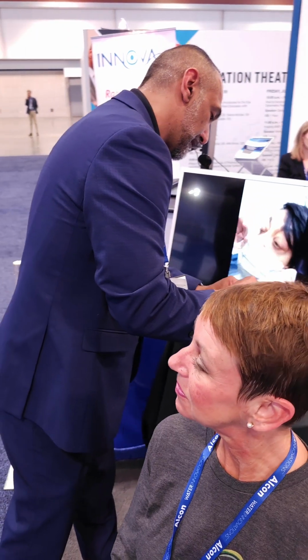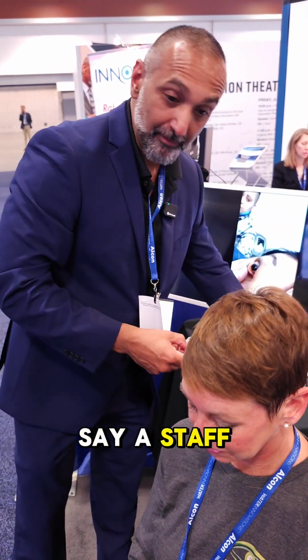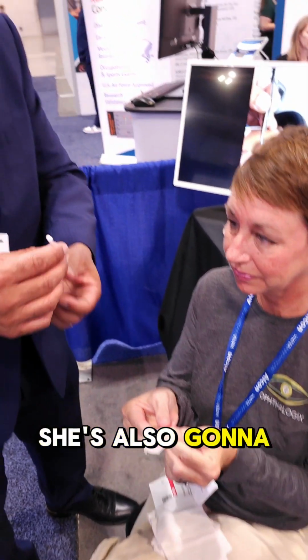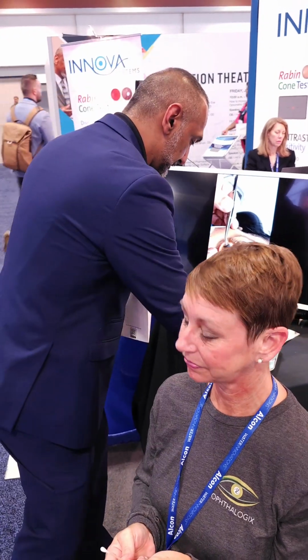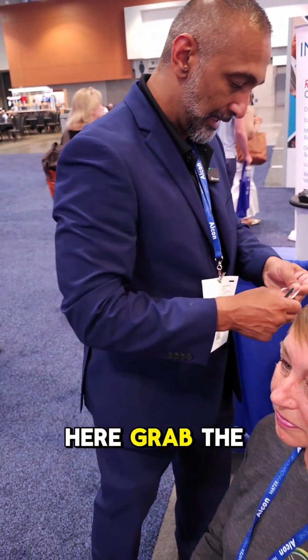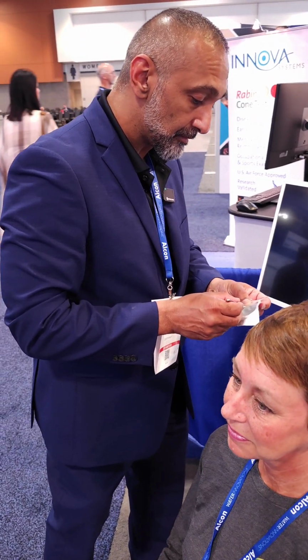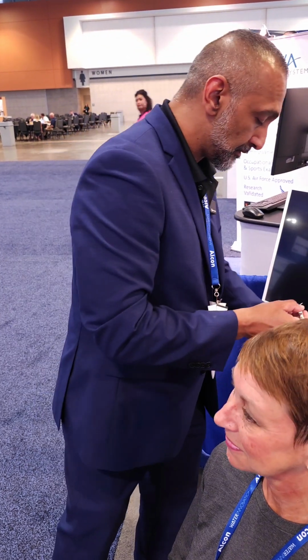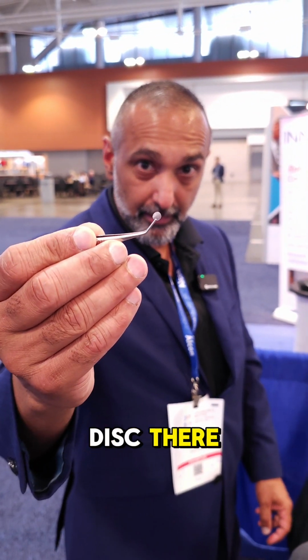If I had, let's say, a staff member or assistant here, they'd be doing this part, but Teresa's going to go ahead and hold the lens. She's also going to hold a rounded ophthalmic sponge here that we can use. I'm going to reach in here, grab the membrane, very, very small, not sure if you can see it, 5mm disc there.